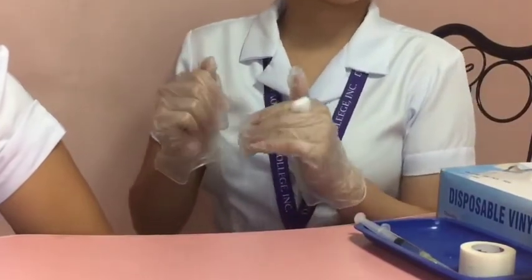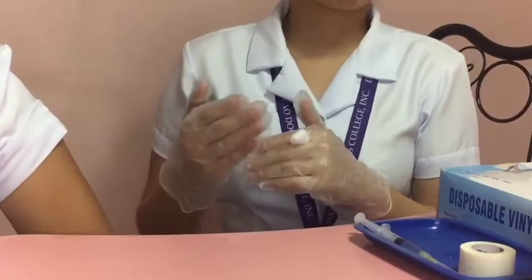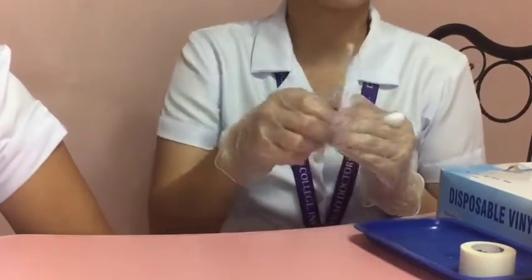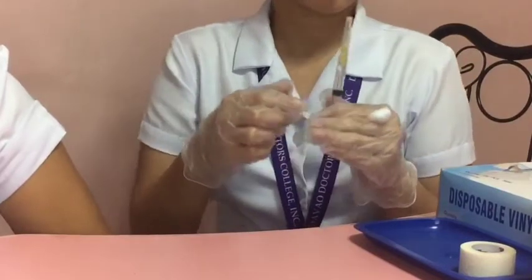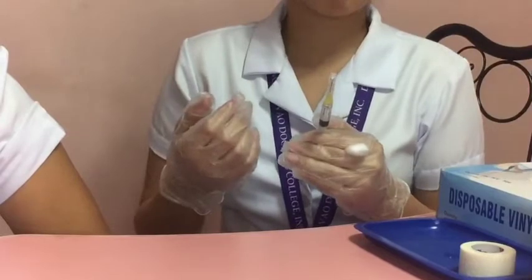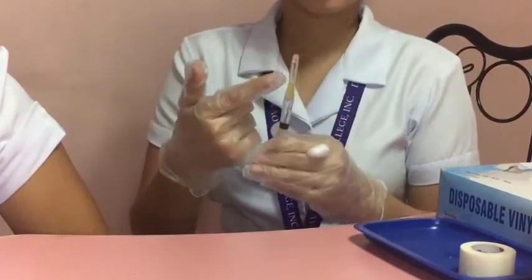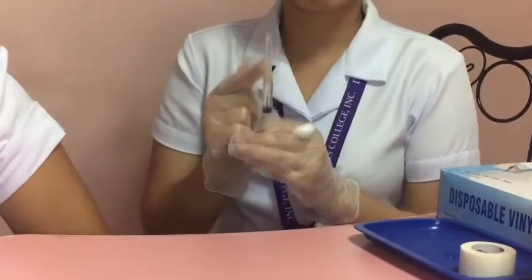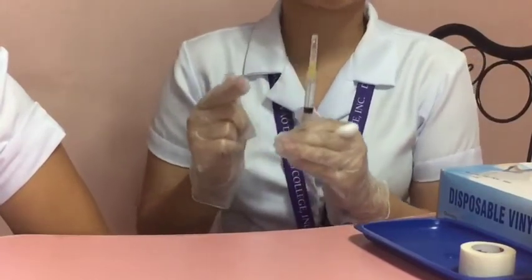So now, let's remove the needle cover. If using a pre-filled unit dose medication, take caution to avoid dripping medication on the needle prior to injection. If this does occur, wipe the medication off the needle with sterile gauze, because medication left on the needle can cause pain when it is tracked into the subcutaneous tissue.